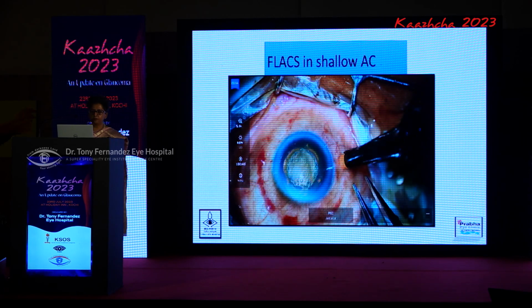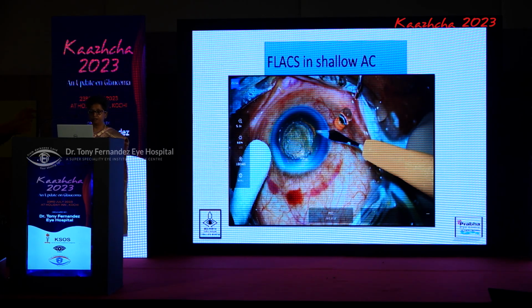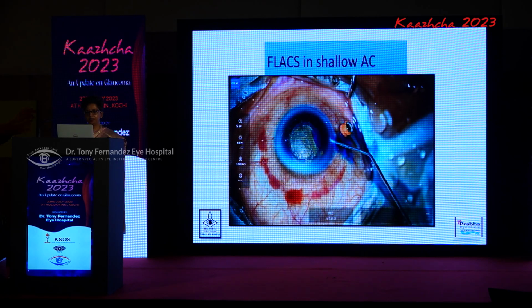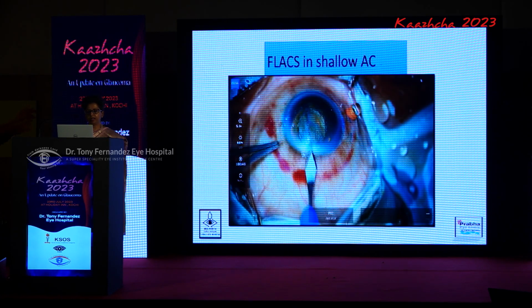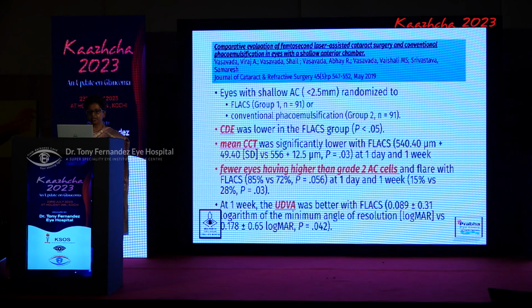So here again we have placed a pars plana port, because with such eyes you can see that it's so difficult to make the side port. You have to be almost touching the iris. So in extremely shallow ACs, place a pars plana port. It makes your surgery that much easier. Highly retentive viscoelastic, and now the AC is formed and you go about the surgery as usual.